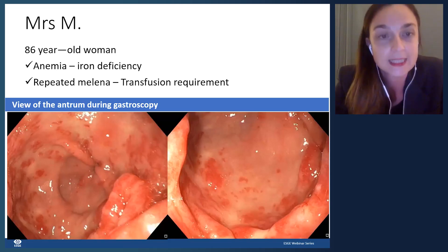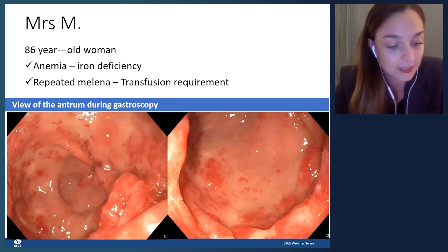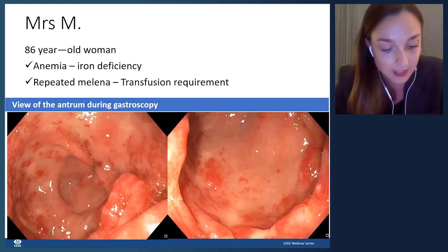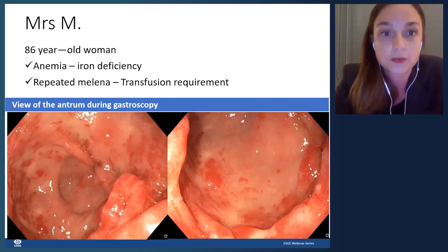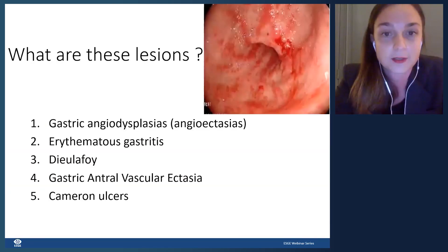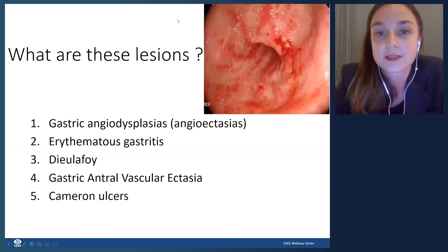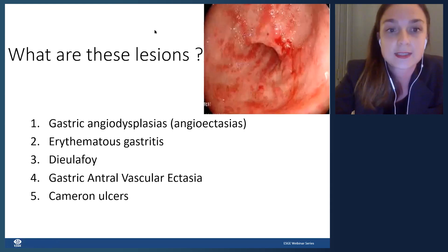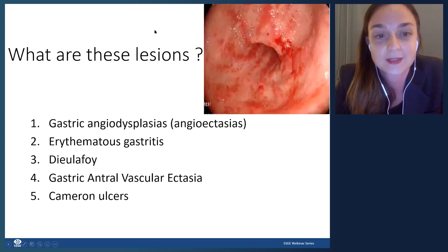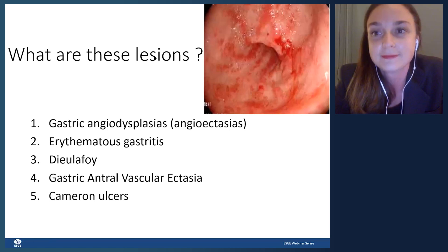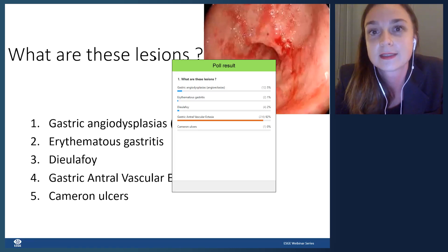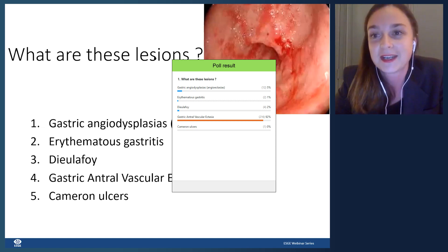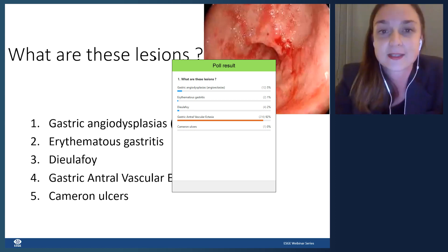Hello everyone, thank you. I'm very pleased to be part of this webinar on endoscopic management of non-variceal upper GI bleeding, and grateful to the ESG for the opportunity to talk about rare causes. Let's start with this case: Madame M is an 86-year-old woman with anemia and iron deficiency, referred for recurrent melena, already requiring transfusions. What are these lesions? Gastric angiodysplasia, erythematous gastritis, GAVE, or Cameron ulcer? The answer: GAVE — watermelon stomach.